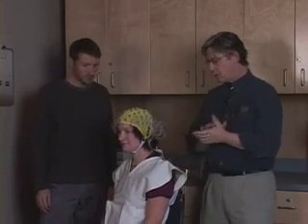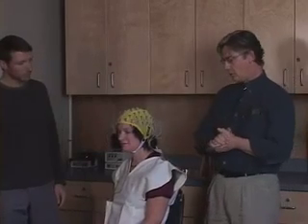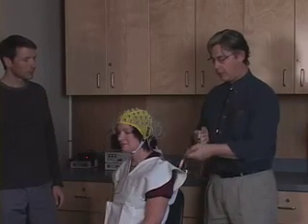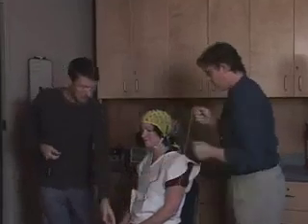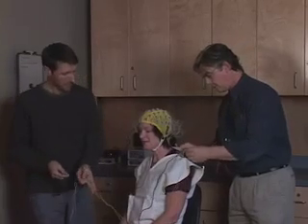Now, we also have other electrodes. Perhaps most notably is our plethysmometry and our galvanic skin response electrodes. I'll just drape that over you, Kate. How are you doing? I'm just fine. Good.